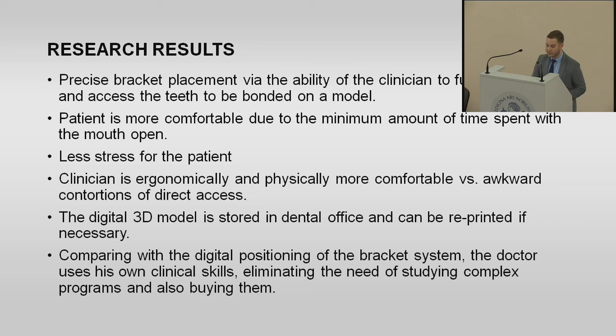So what results did we get? Precise bracket placement via the ability of the clinician to fully visualize and access the teeth to be bonded on a model. So that's a very great advantage. The patient is more comfortable due to the minimum amount of time spent with the mouth open. One jawbone requires around 15 minutes of clinical work. That is much less than you do with direct bonding. Less stress for the patient, no doubts.